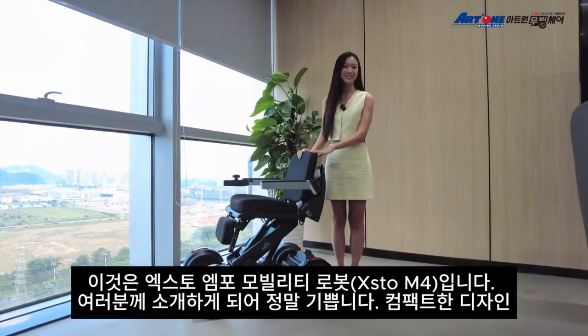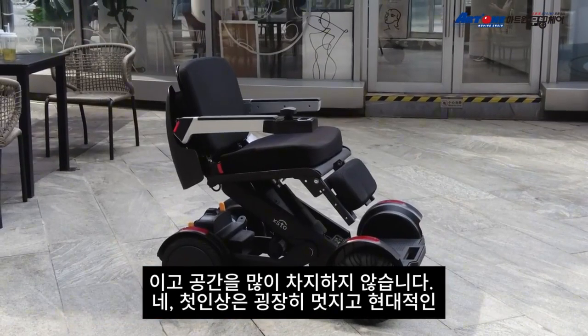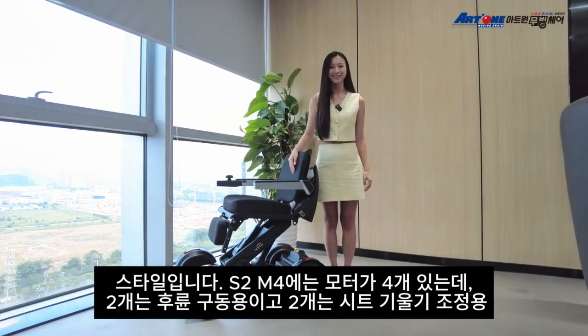This is XSTO M4 Mobility Robot. I'm really excited to introduce it for you guys. Its compact design doesn't take much space. My first impression is that it's super cool and in the modern style.